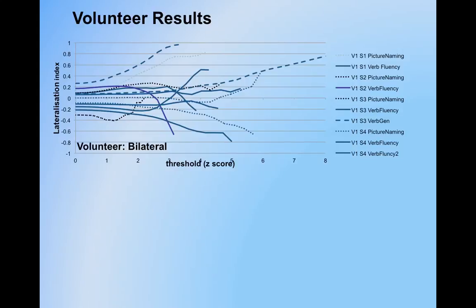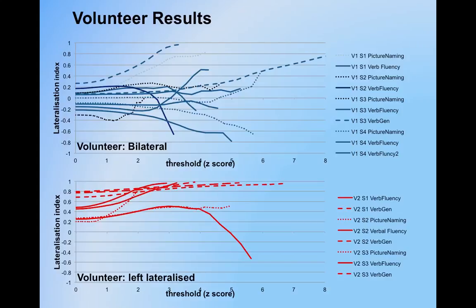So again, this is a bit of a conundrum. We did someone else who we thought was purely left lateralized, and you can see now they seem to be a bit better, but there's still a lot of variation. You know, this is the same person being tested over and over again. You'd hope that you end up with a consistent answer.